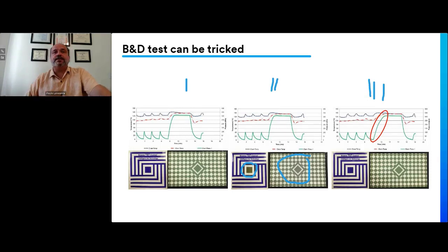Then in phase three, I had air being injected into the chamber, like in phase two. But this time, instead of a normal come-up curve, what is the come-up curve? It is the time, or the curve, from the last vacuum point until the beginning of the exposure phase. What I found after looking at over 90 different sterilizers is that most of them, over 70%, had a really long come-up curve.